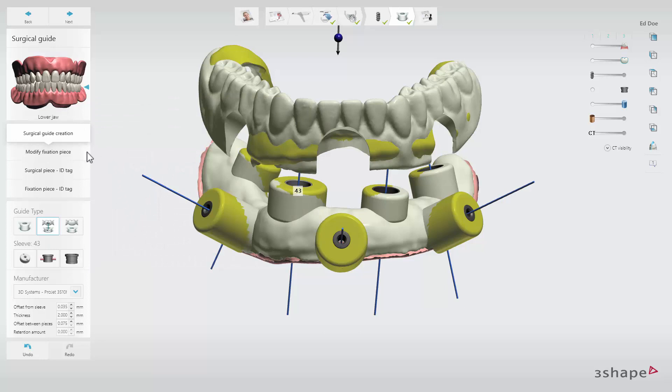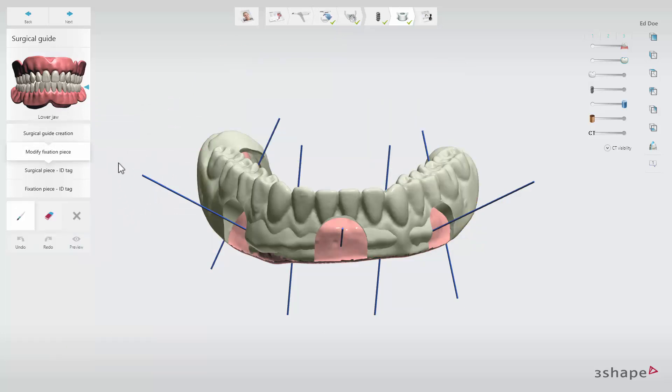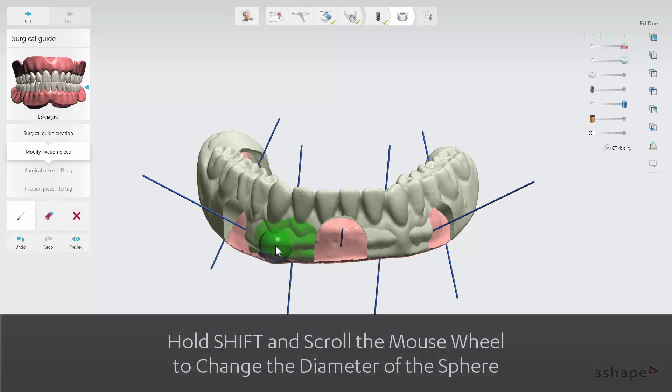At the Modify Fixation sub-step, you can remove excessive material on the fixation piece of the guide if needed. Press and hold Shift and scroll the mouse wheel to change the diameter of the sphere to modify the area of removal.